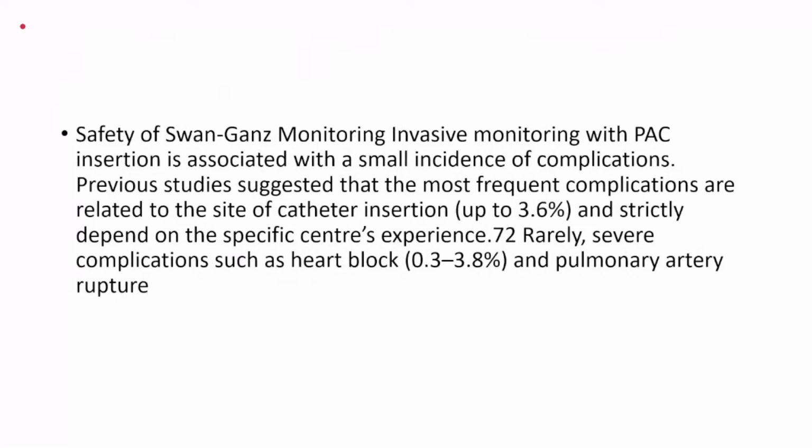Talking about the safety of Swan-Ganz monitoring, as I told you, I have not seen any major life-threatening complication in my personal practice. It is associated with only a small incidence of complications. Most frequent are related to the site of catheter insertion, that is puncture related, 3.6%. And they strictly depend on specific centers' experience and expertise. The rare complications are heart block and pulmonary artery hemorrhage, which are very few.